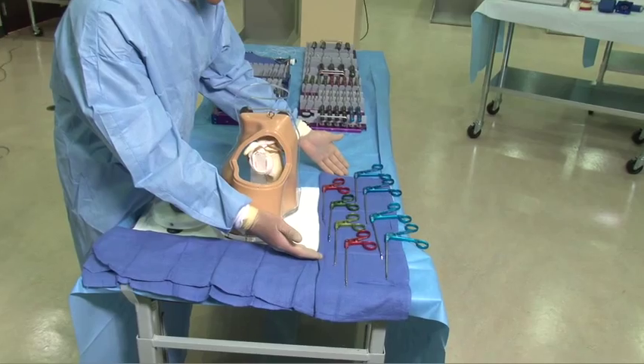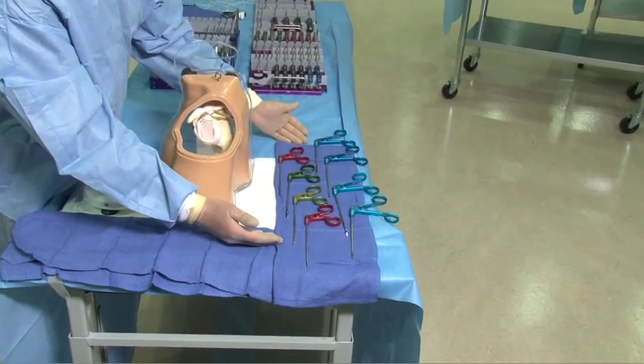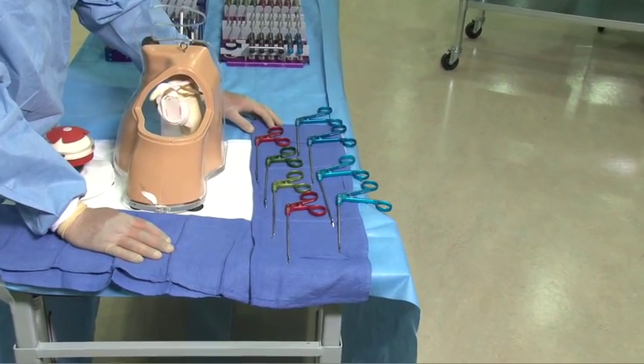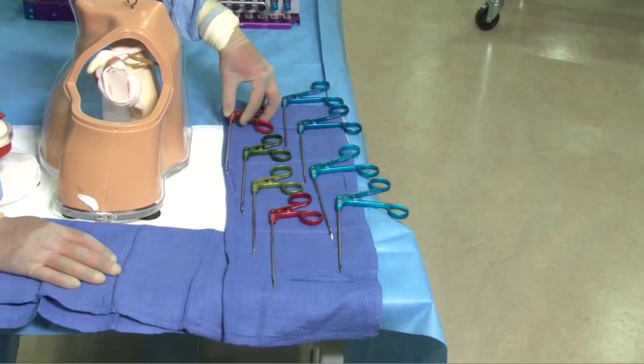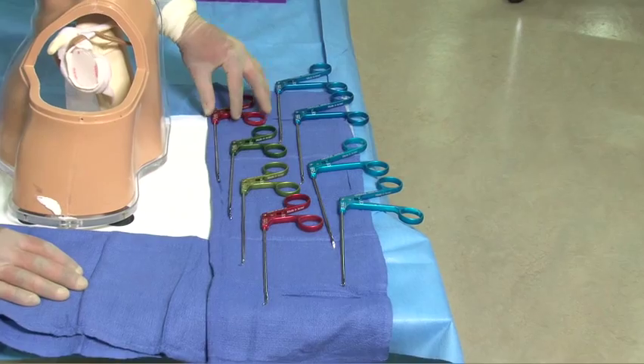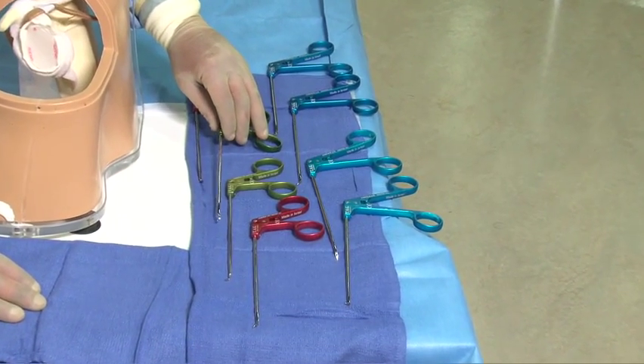As we can demonstrate here in the TAG set, color coordination allows for an understanding that the red devices are left-sided devices and the green devices are right-sided devices.